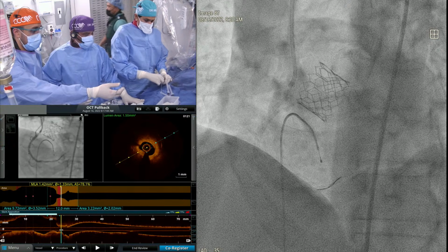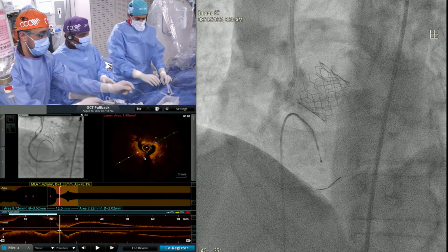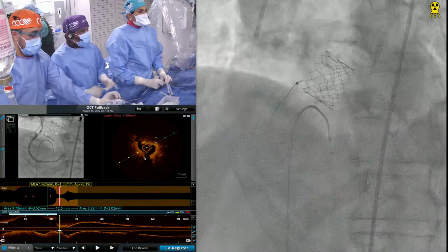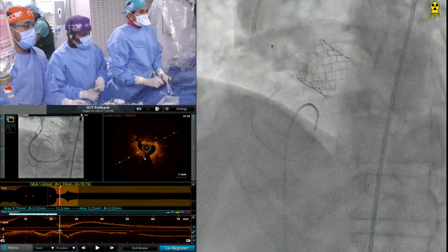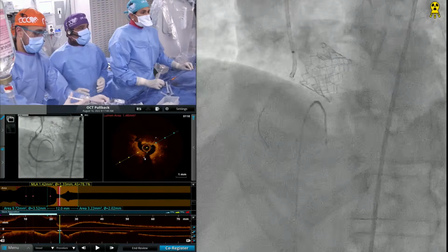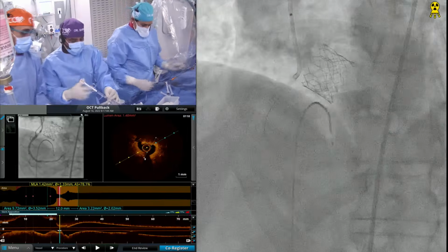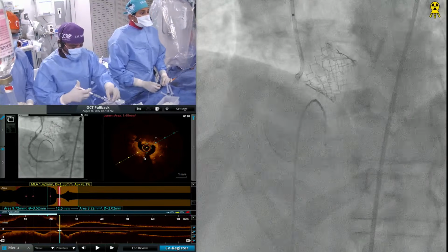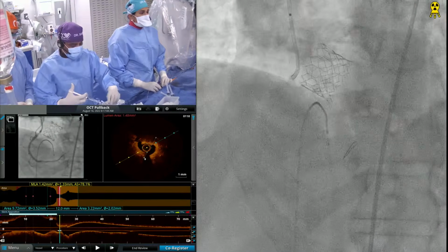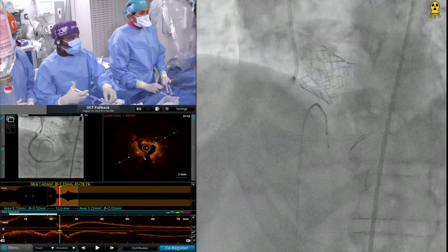Okay, 45, 25 is fine. So this one we'll do with saline. Always with saline, yes, except in the under-expanded stent, where you go with the dye. That's the only exception. But yes, always with saline. But in the stent, you are less worried about the issue of perforation or dissection.